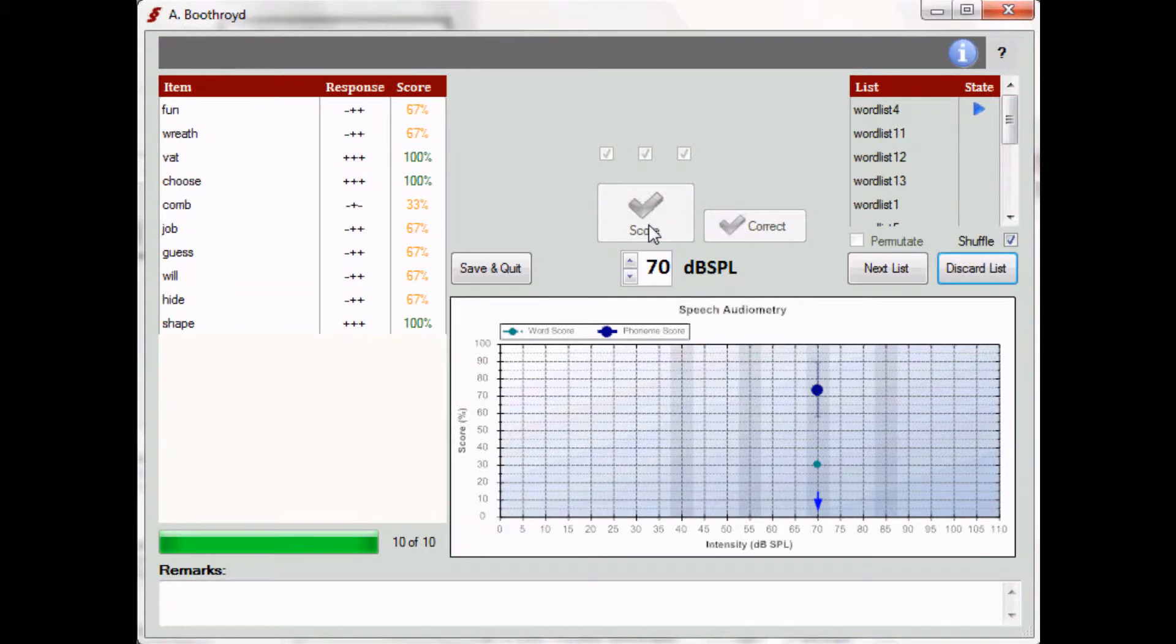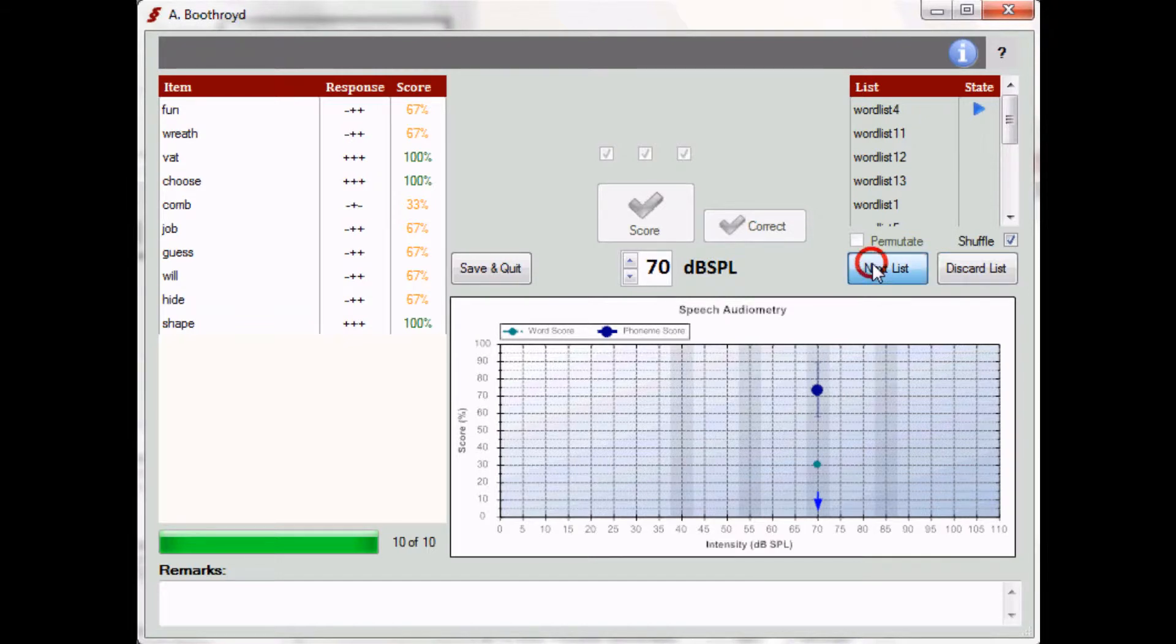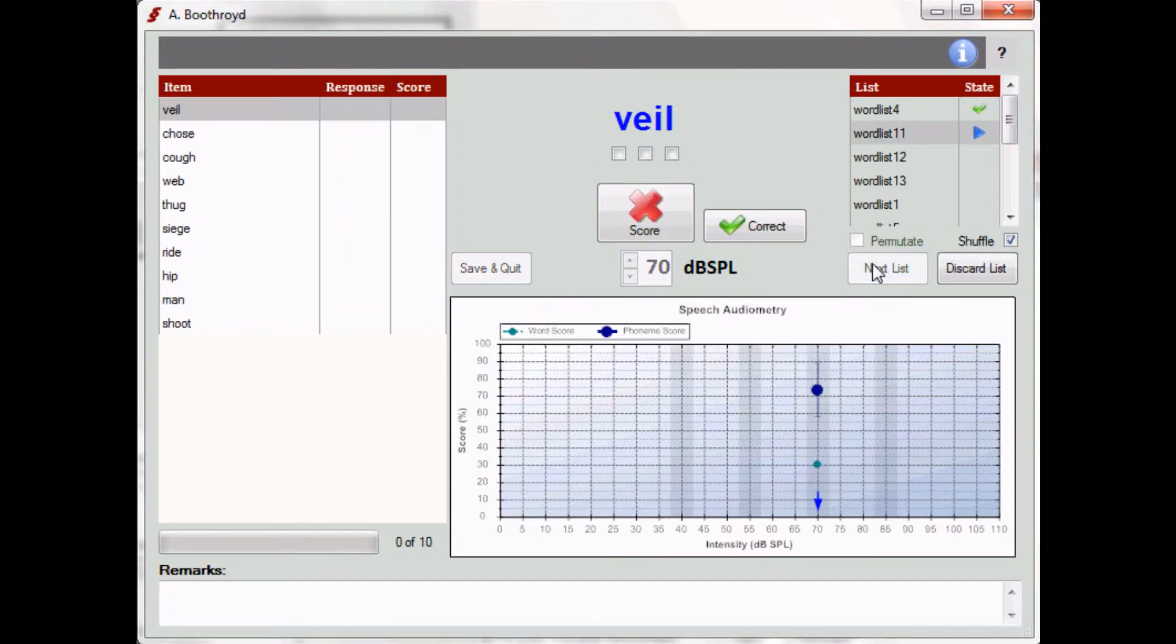At the end of a list, you can choose to present a new list at the same presentation level. This will improve the robustness of the result. It will yield a smaller confidence interval.